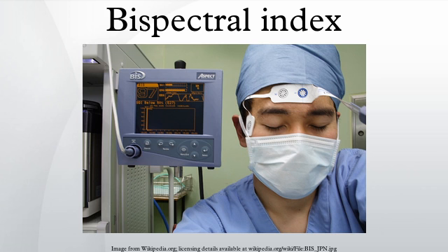However, this result was not reproduced by a recently published randomized control trial, the B-Unaware trial. In it, the use of BIS monitoring was not associated with a lower incidence of anesthesia awareness.